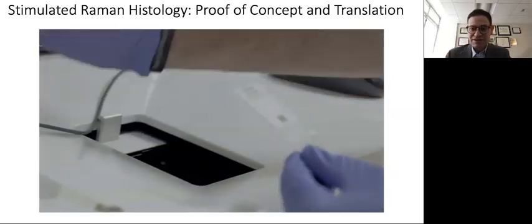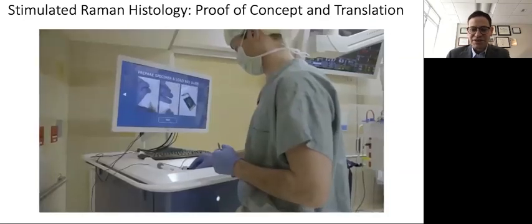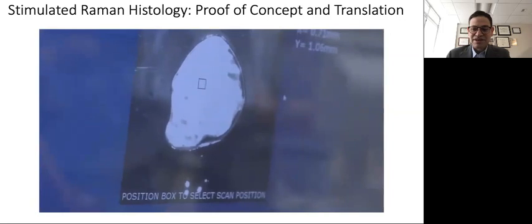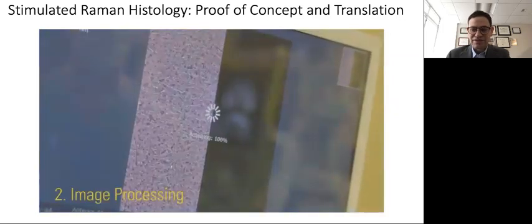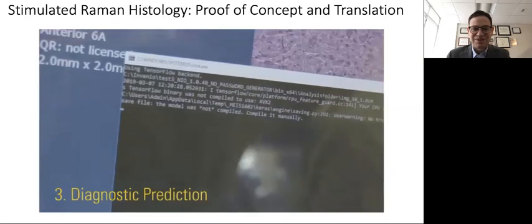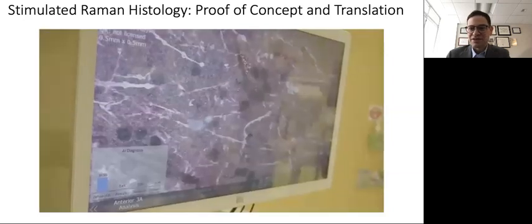Because the surgeon has a lot on his or her mind, and because histologic images contain a huge amount of information, we rely heavily on image analysis to ensure that the data created by the imager comes to life and can be easily integrated into the goals of the operation, whether that goal is simply establishing diagnosis or ensuring maximal safe resection. Here you'll see as the images come up, they're processed, and using TensorFlow, as you can see here, we're able to render a diagnostic prediction about the most likely etiology of this patient's tumor.